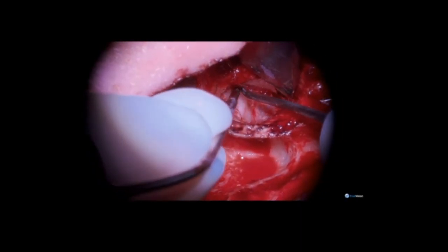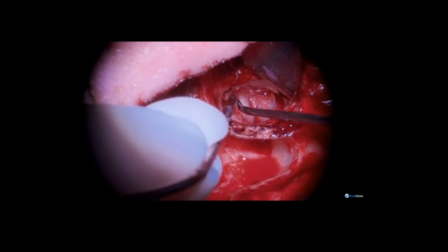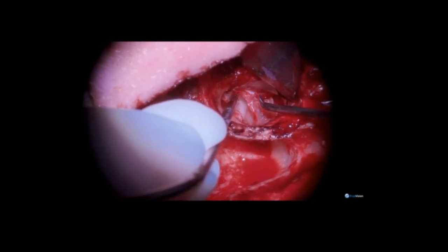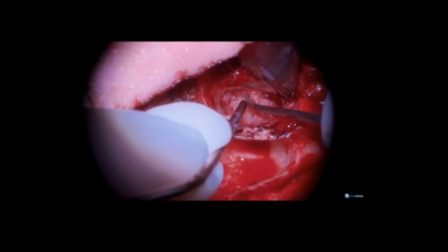With a duckbill elevator, I am gently elevating the anterior superior annulus so that I can get a good underlay graft. I am also exploring this region carefully to make sure that there is no retained shedded keratin debris.